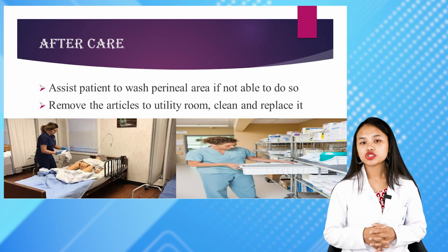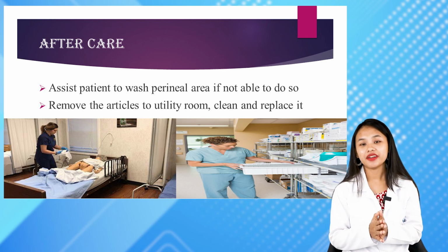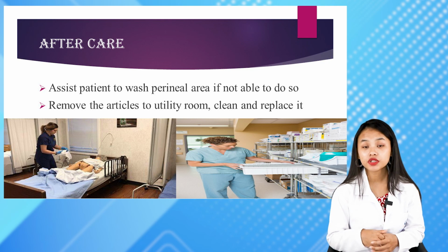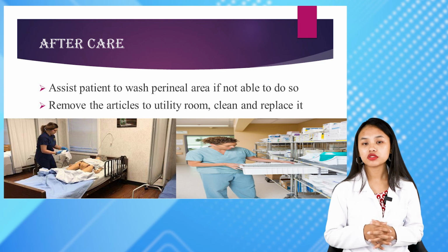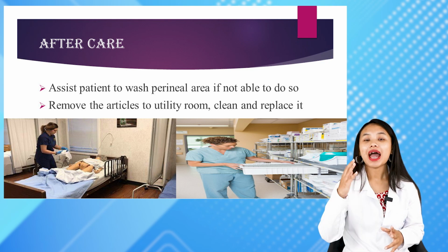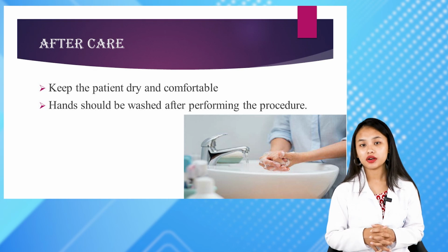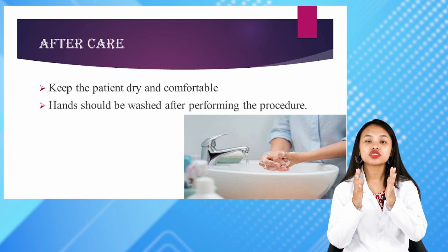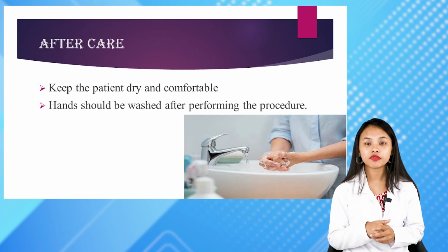And then we can also assist the patient to wash the perineal area if they are not able to do it by themselves. We must replace back the articles and discard the ones which are required, as well as we must wash our hands. These are the various steps that you must do even after the procedure has been performed.